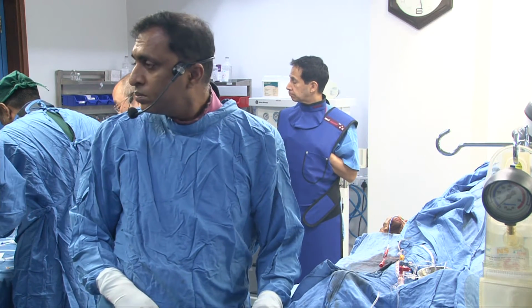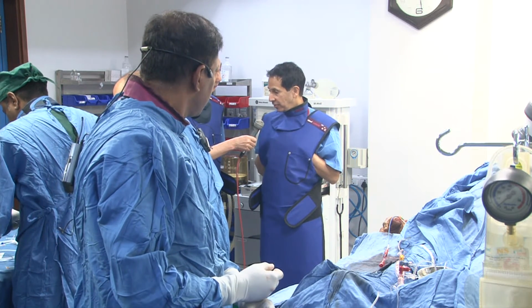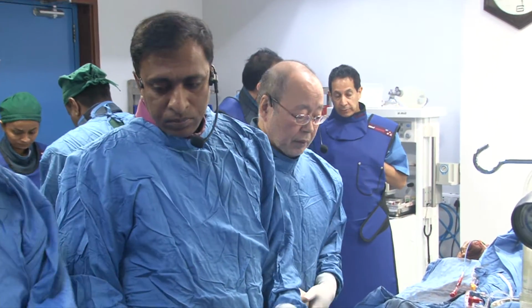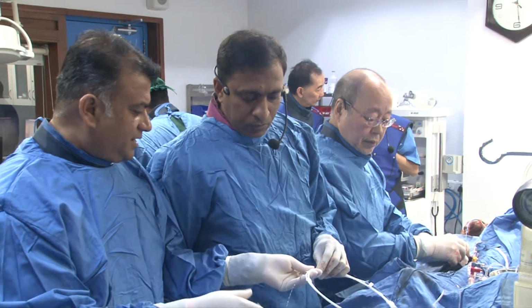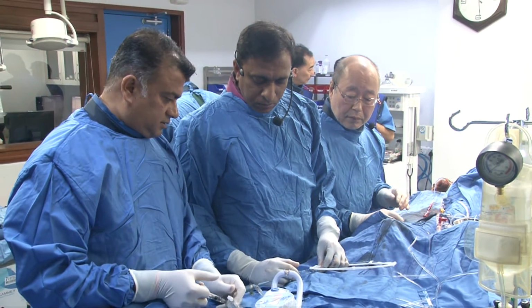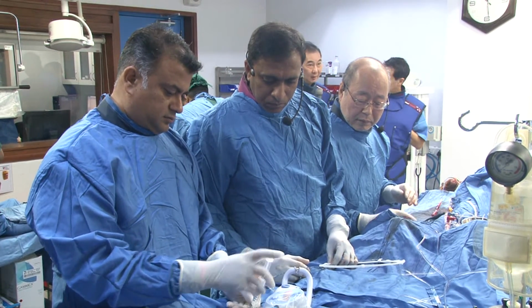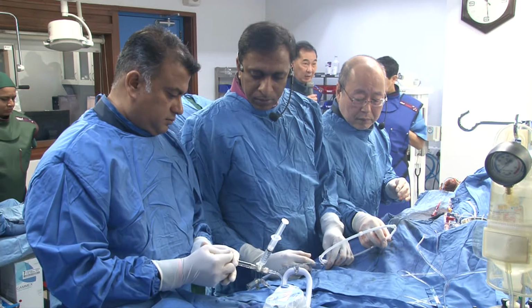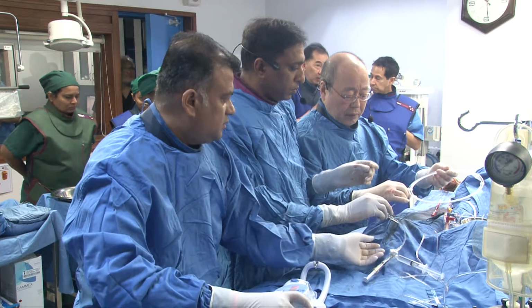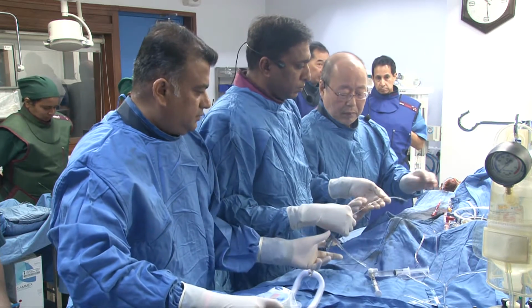Would you do 1.75 in this vessel? I would do what the IVUS tells us to do, or the OCT tells us to. Honestly, fluoroscopically it doesn't seem like too much calcium. If it's not overly calcified, I would be with Malcolm here: balloon, nitro, IVUS-guided stent diameter. I think that's what we routinely do. Only if I cannot put the balloon down in an undilatable vessel, then I do the rotablator or laser. But if it's balloon dilatable, I will not consider that.